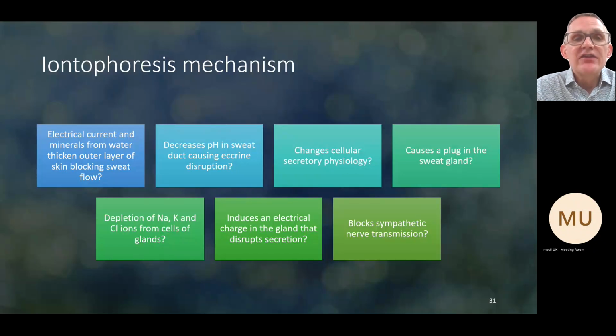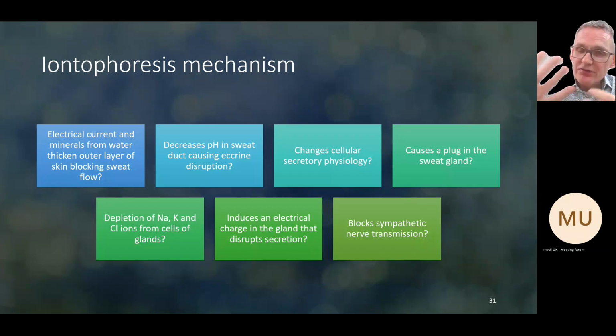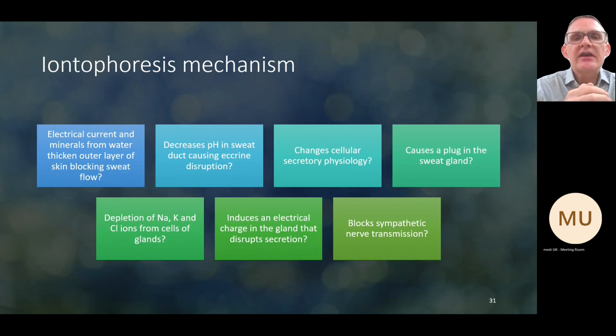We don't fully understand how iontophoresis works. It's applying an electric current, it's driving ions into the skin. It's going to irritate the skin, and if you irritate the skin, then you tend to get a thickening of the skin, so the keratin layer starts to get thickened. We think that the duct gets irritated and so undergoes some metaplasia and narrows the diameter of the duct. You're driving ions into the sweat glands, which is going to alter the pH because you're driving hydrogen ions into there. It's probably a combination of these factors, and ultimately you do get a sort of physical plug formed in the duct leading from the gland, but it's a more lasting effect than antiperspirants.